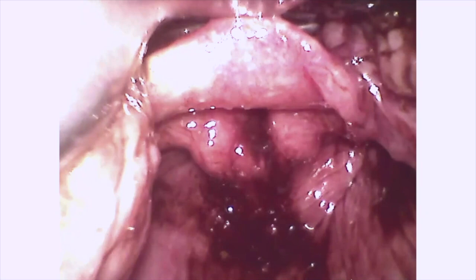It's always the context of the patient, right? You're like, is this a traumatic case? Is this an infectious case? Tumor that's bleeding, that's the other thing you want to consider. Looks acute though in this case, but especially if I'm seeing a lot of friable tissue that bleeds, I would consider does a patient have a tumor or something.